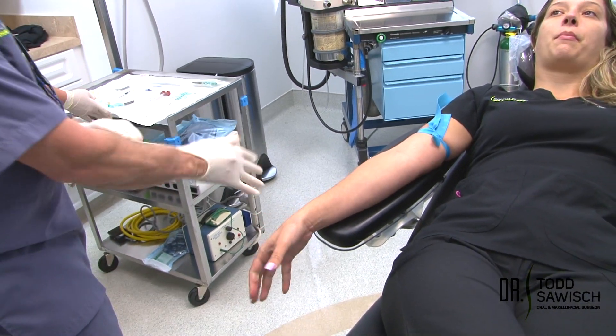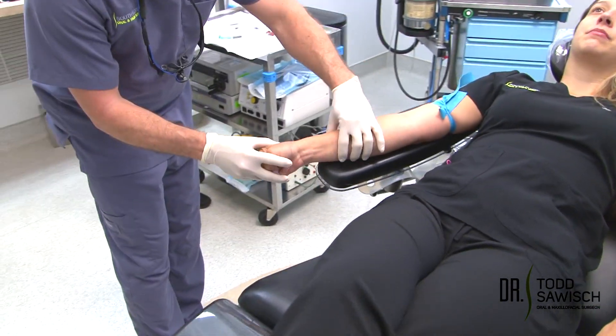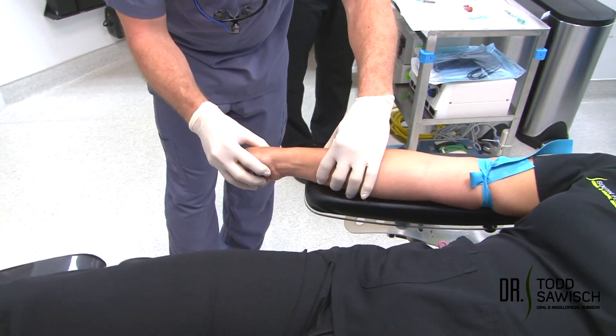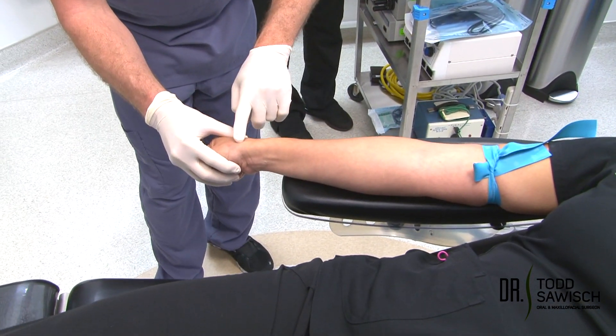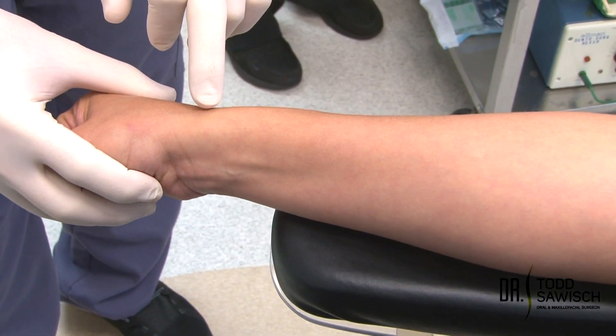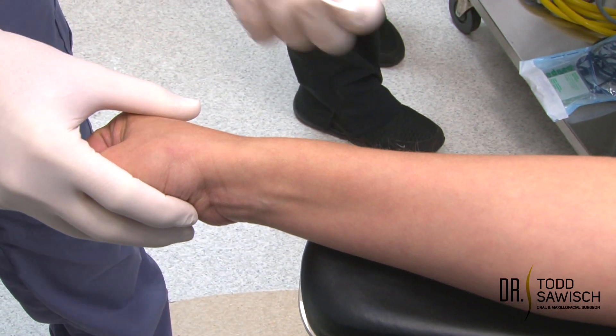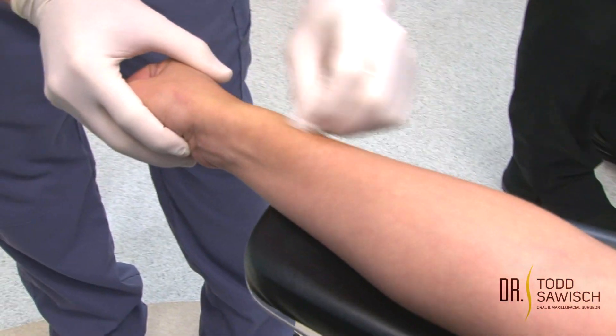If you're starting an IV in the wrist, you want to make sure that there's good support under the wrist. I'm going to take the patient's wrist and bend it like this — it's going to make the vein pop out more. She has a very good vein, but we're still going to use local anesthetic, as we started here because it's very sensitive. The first thing we're going to do is take an alcohol pad and cleanse the area.